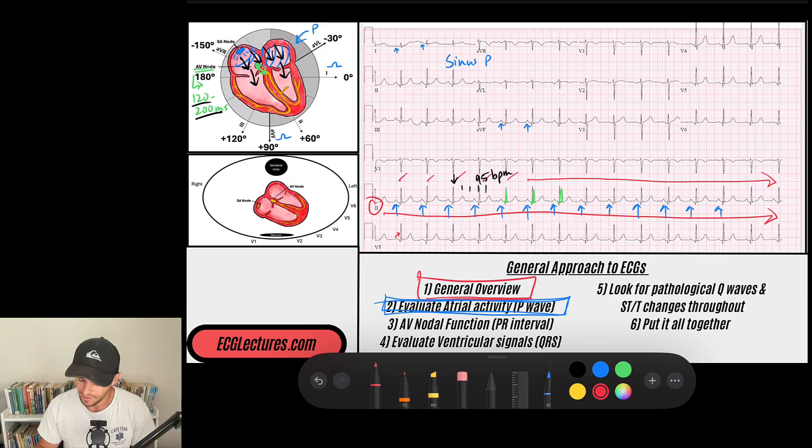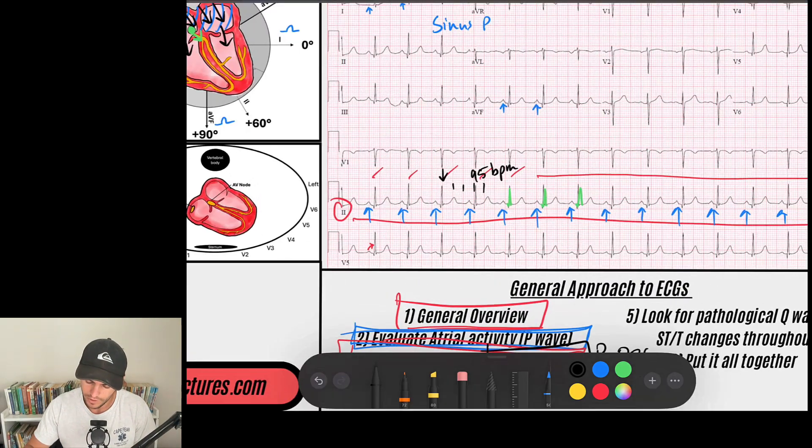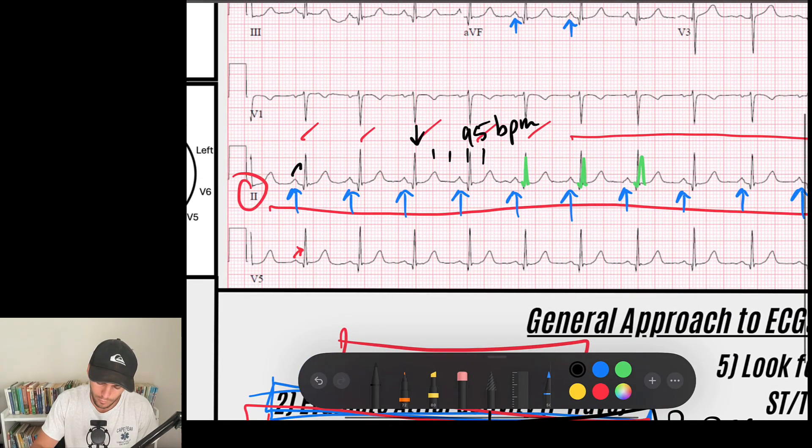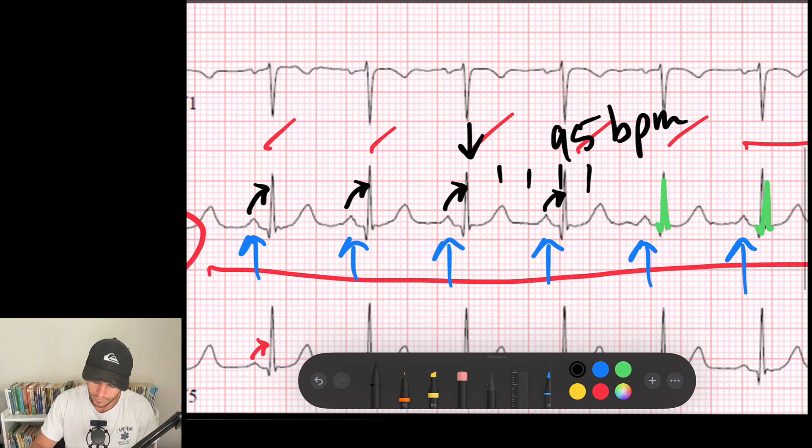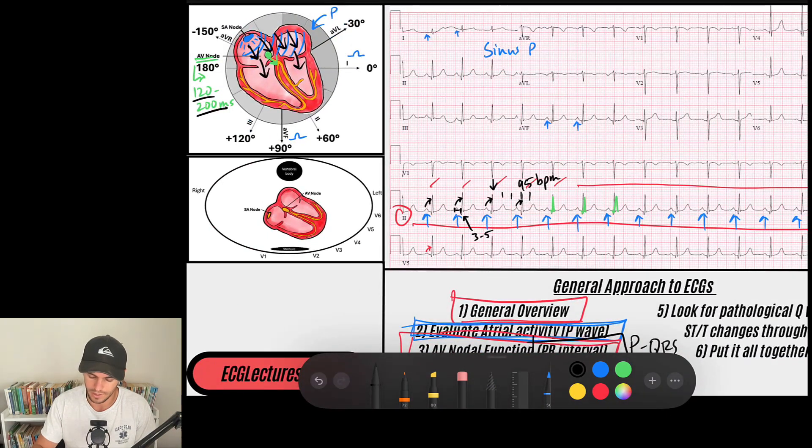So whenever I evaluate my AV nodal function, I'm specifically looking at PR interval, or AKA the relationship between the P wave and the QRS. What is that relationship? In this case, we notice that there are P waves before every QRS. These are my arrows. These P waves are conducting to QRS complexes. When I measure the PR interval, I notice that the PR interval is somewhere between three to five small boxes, which is 120 to 200 milliseconds.